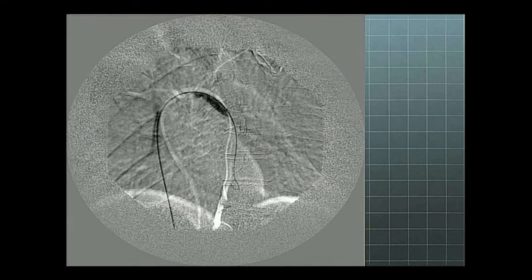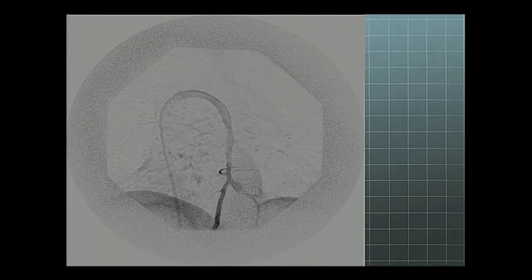Here's one where I put my catheter in, everything went retrograde, no antegrade flow. We dilated up in the arch. This is where the stenosis was. You can see there's a little bit of a web, and these can be difficult to see or even appreciate. It's just a very subtle indentation, probably a web or a valve. But then post, marked improvement. Dramatic improvement. Now there's flow where there was none before.